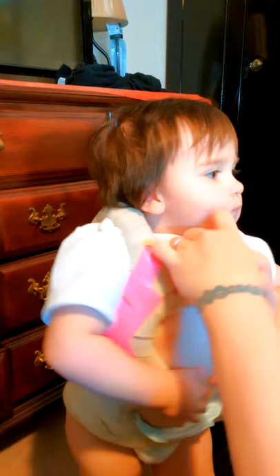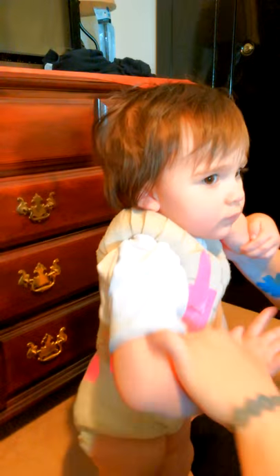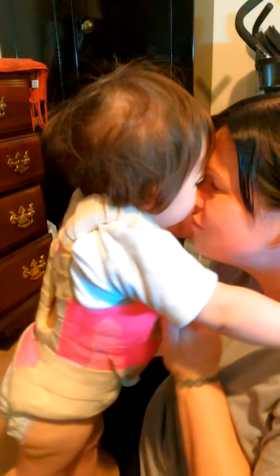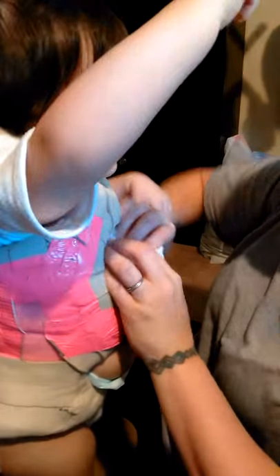She's burping from dinner. So let's do the sides — from here we just kind of snake it down. She just kind of snakes some of it through there, tries to keep the neck even.